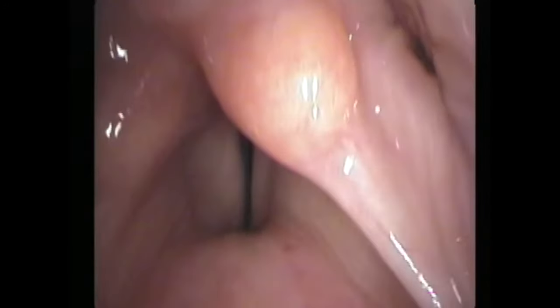But let's slow things down and look at the left side. First of all, it's not paralyzed - it is moving. It just does not move through a very large range. The left vocal process clearly opens during inspiration, and during a sniff it opens even further. But during the sniff, the left vocal process never rotates laterally - it's as if it has tonic input keeping it from rotating out fully.